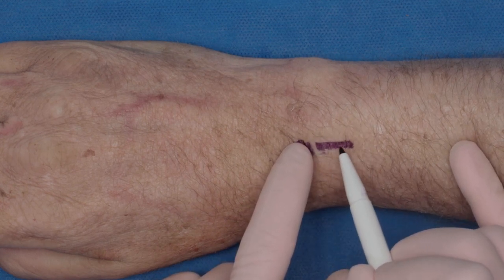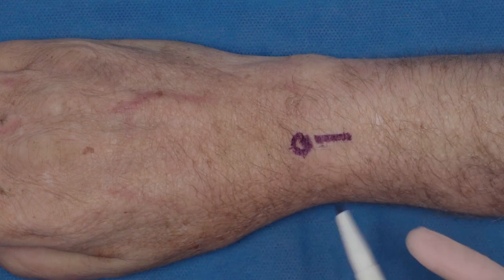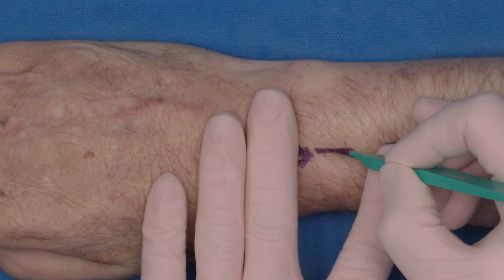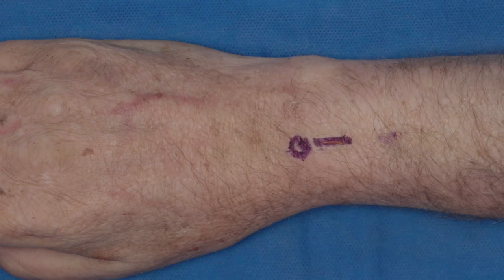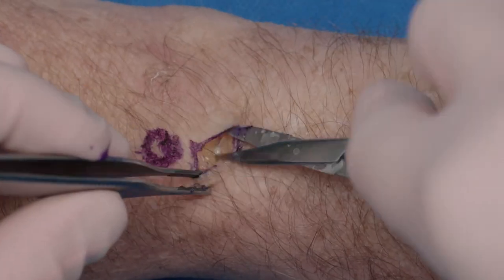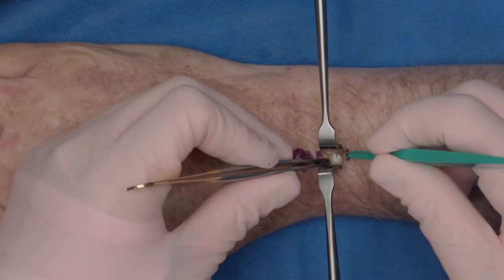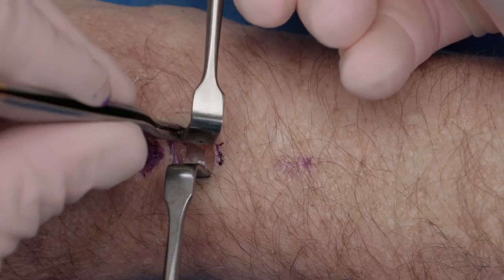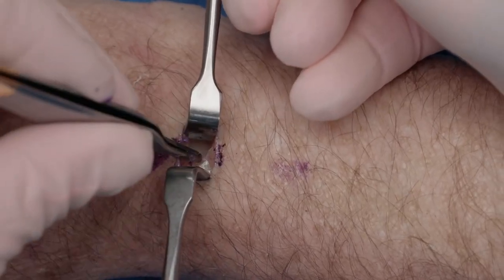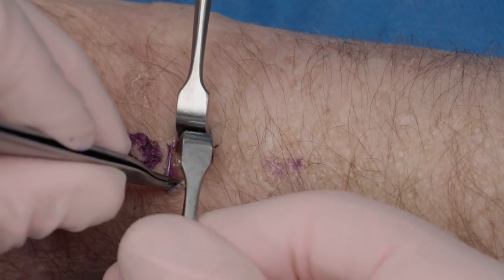Realistically, you can make the incision just the size of the OsteoAuger — for this demonstration I'll make it slightly larger. After incising through skin, I then dissect down to the extensor retinaculum, which you can see as the white structure. Once you see that, you want to divide the extensor retinaculum. You really do not want to drill through it, because you can drill into one of the extensor tendons. After dividing that, you can take the tendons out of the way, and then you're directly down onto the radius.